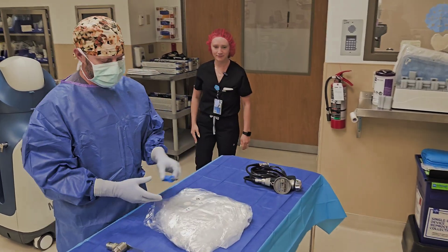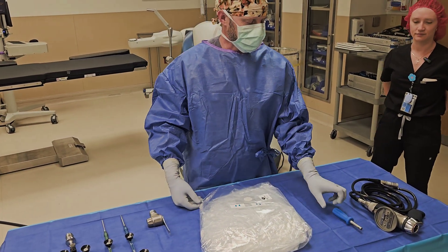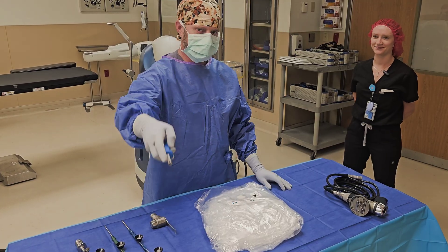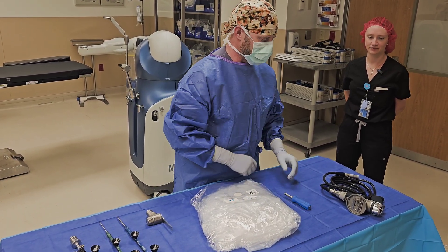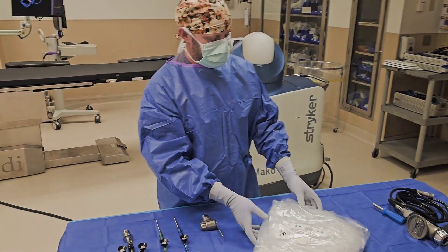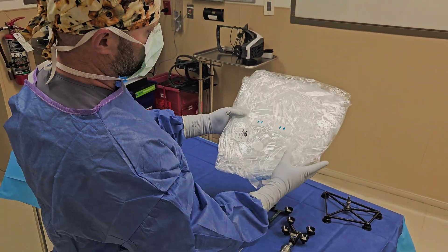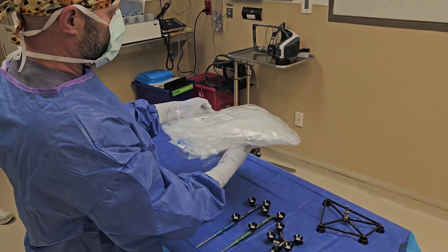Now that everything is set up, I have my screwdriver — not to be confused with the checkpoint inserter on a hip case, which has a similar shape at the end but is not used here. On the drape there are simple pictorial instructions: left hand number one, right hand number two. Simple enough.